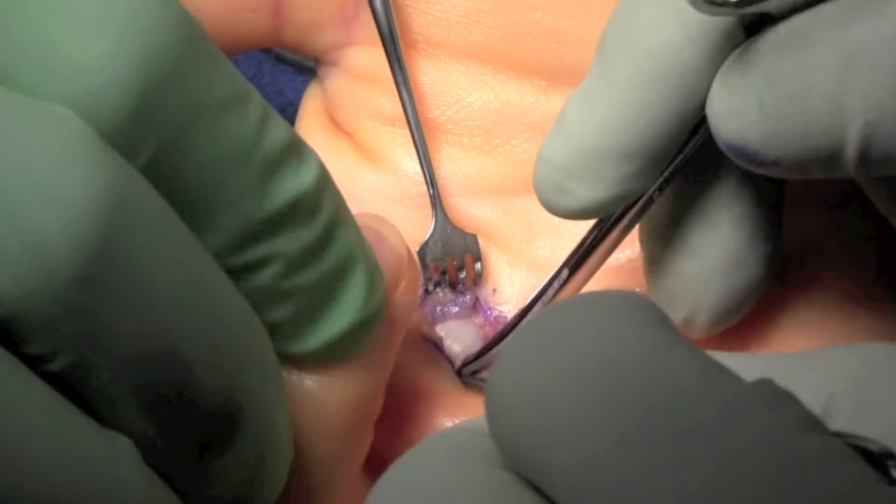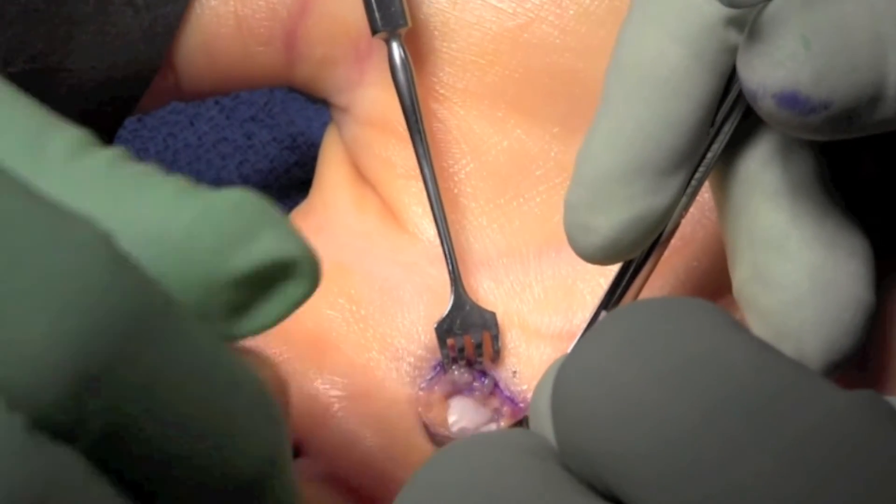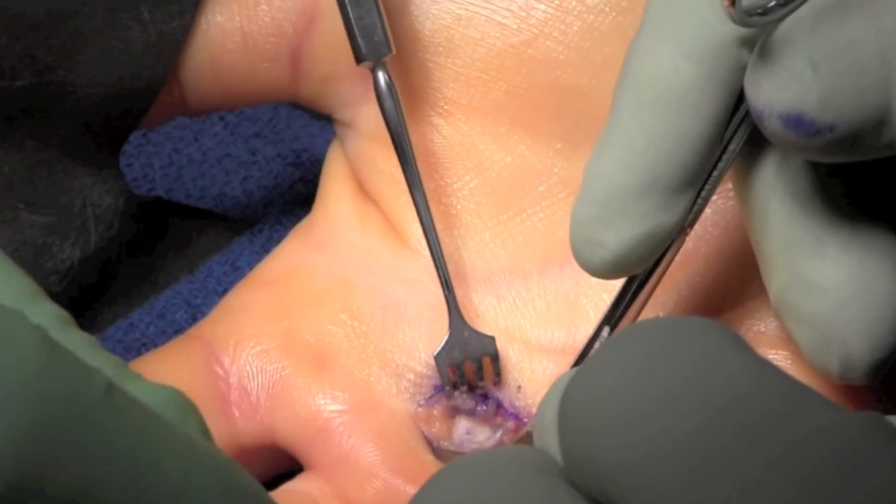I do not typically deliver the tendon completely out, but we do want to make sure that there is no evidence of tendon disruption or injury. Here we can see the tendon moves quite freely.